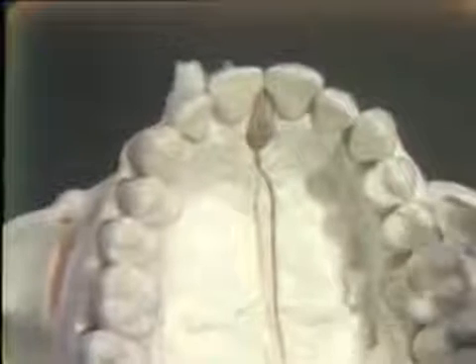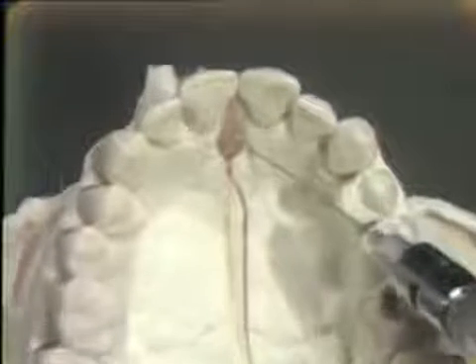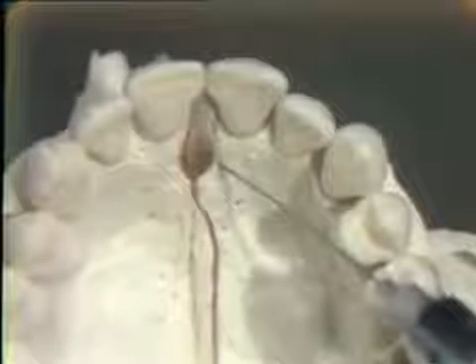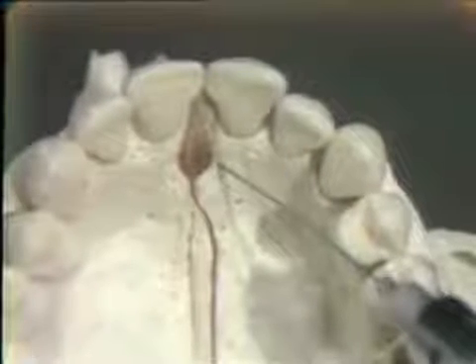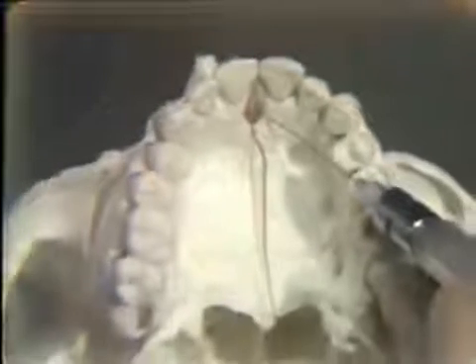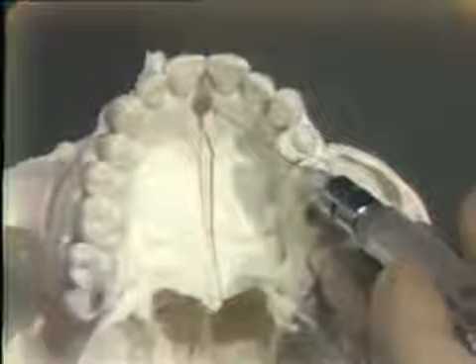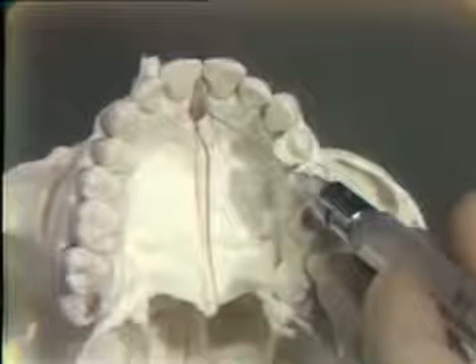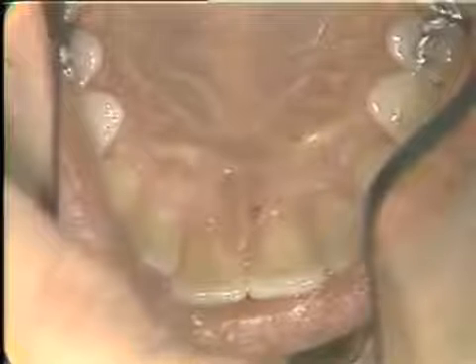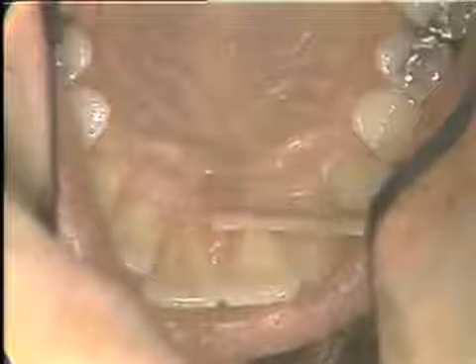So demonstrating that for us on either side, carried quickly into bone, aspirate, and then again it takes quite a little pressure on the plunger to get some solution out into these fibrous tissues. But again, you will see them blanch as it occurs and know that you've accomplished getting some solution out into those tissues.